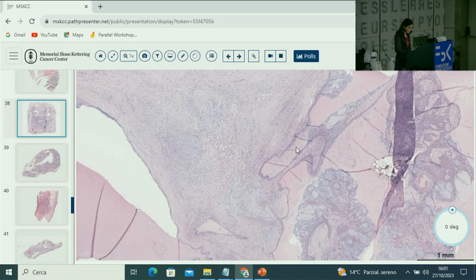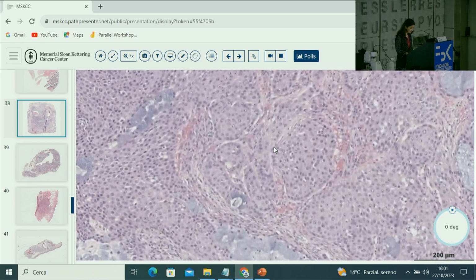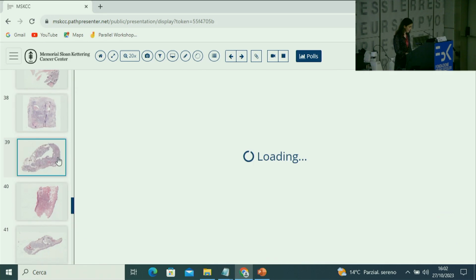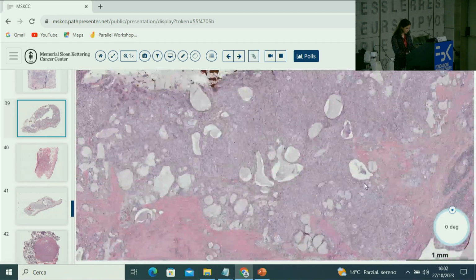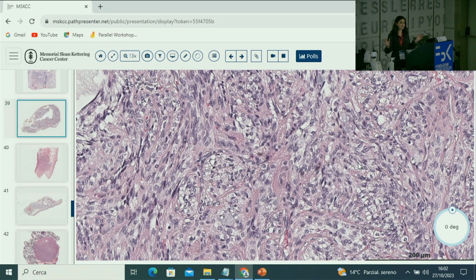And this one is more of a mucoepidermoid carcinoma. It has cystic areas and solid areas. How do you describe these cells? Oncocytic, so this one is an oncocytic variant of mucoepidermoid carcinoma. I think it's a spectrum: the oncocytoid cells can look apocrine, and if they're very pink, you can see a spectrum of oncocytic changes. When we did the study, we noticed this has been reported, but it's also a pitfall because it can have spindle cells. The intermediate cells can have different morphology: oncocytic features, spindle, foamy. They don't always look very squamous.